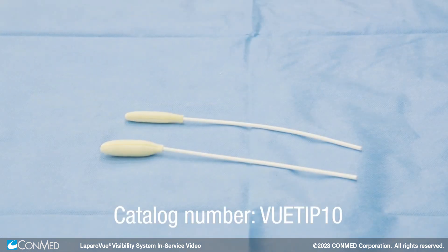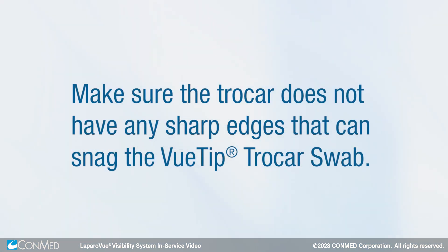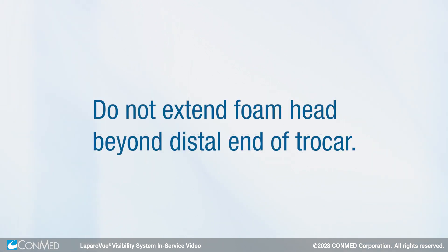The view tip trocar swabs are provided to clean the inside of trocars. The small trocar swab is for 5 to 8 millimeter trocars and the large is for 8 to 12 millimeter trocars. For best results, we recommend using the small swab for 5 to 8 millimeter trocars and the large swab for 10 to 12 millimeter trocars. Make sure the trocar does not have any sharp edges that can snag the view tip trocar swab. Do not extend the foam head beyond the distal end of the trocar.